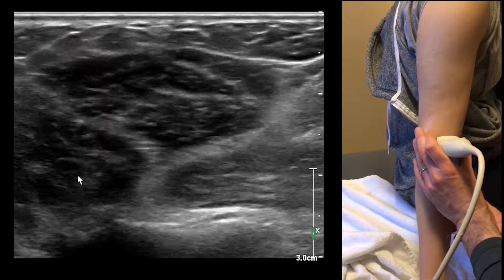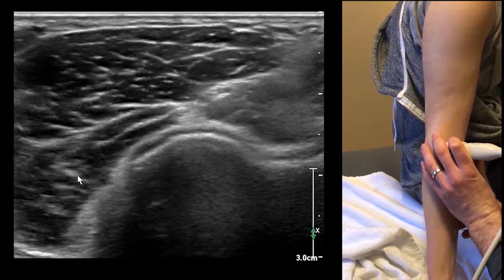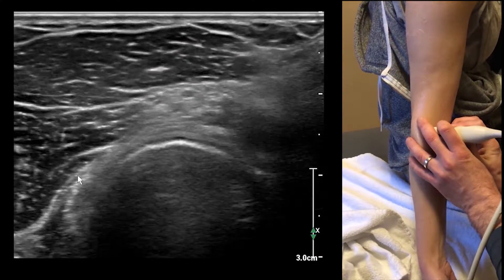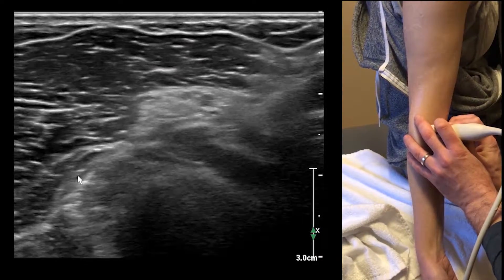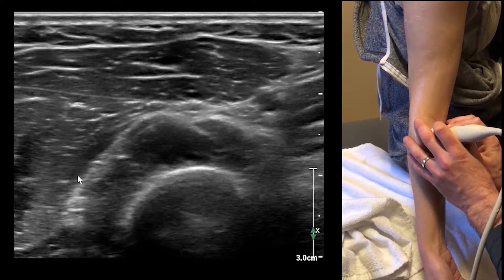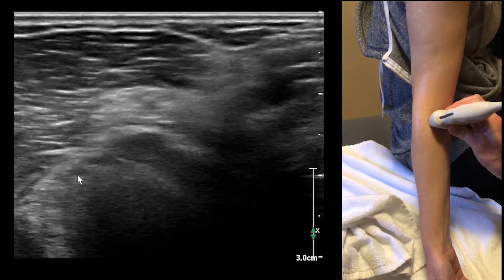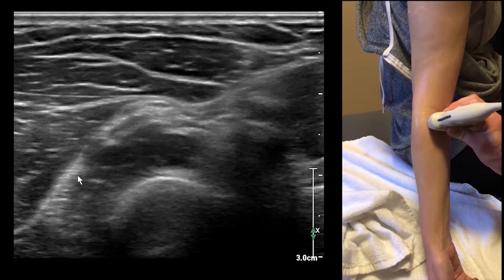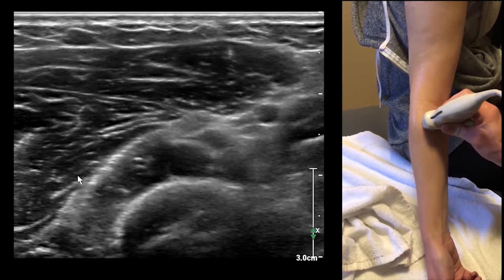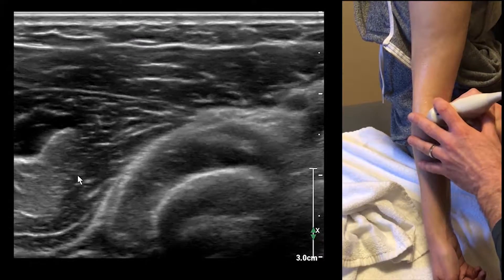We're going to come up to the radius, and as we cross over the radius and the radial head, we're going to see that it splits into superficial and deep components. The deep is going to be the posterior interosseous nerve, and the superficial is going to be the superficial branch of the radial nerve. The posterior interosseous nerve is going to run through the supinator itself.